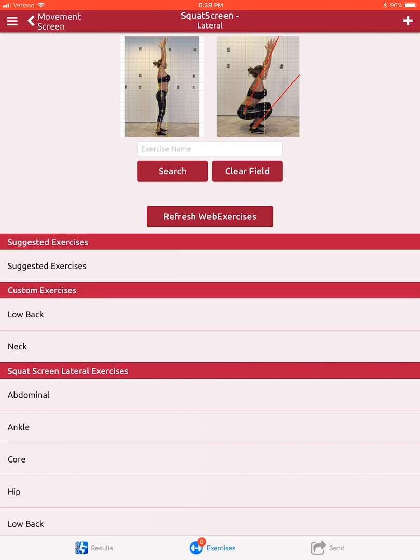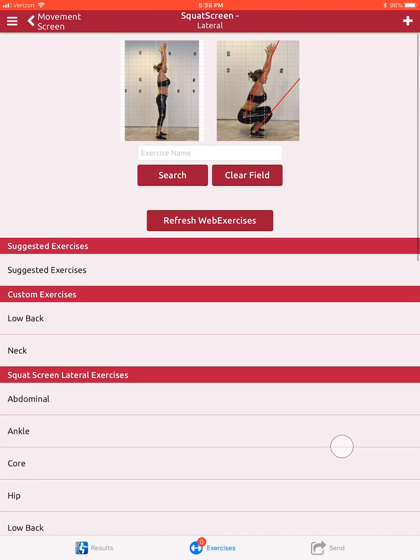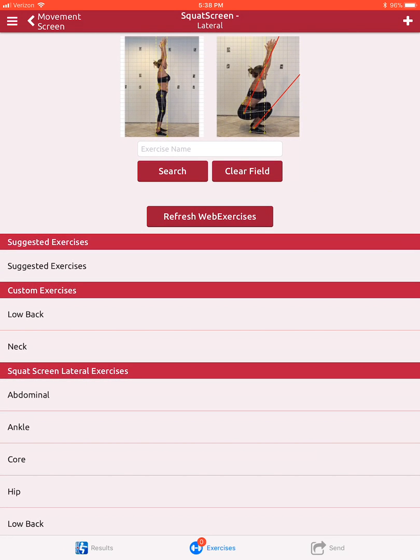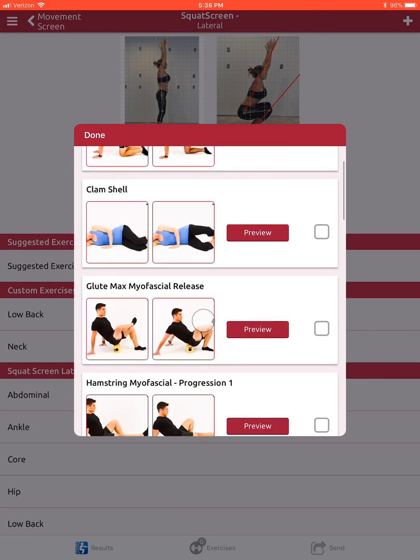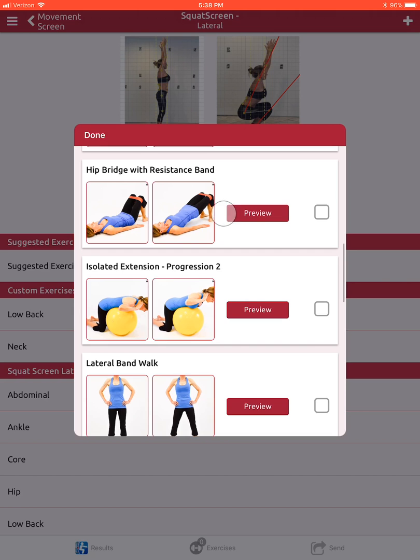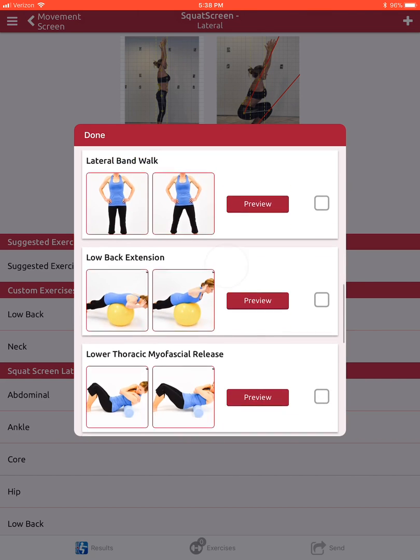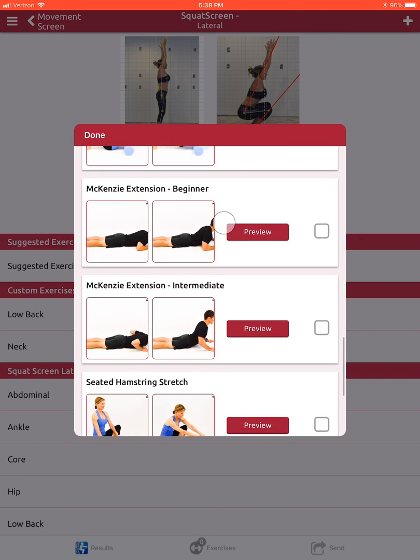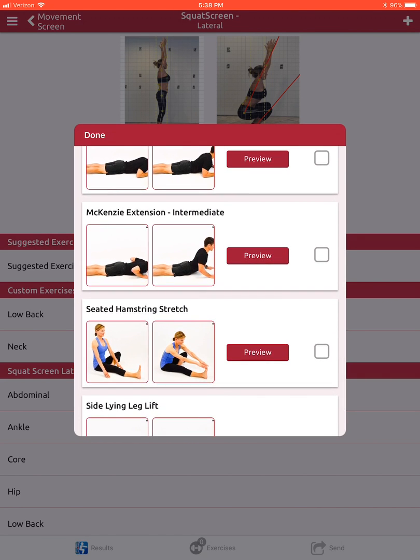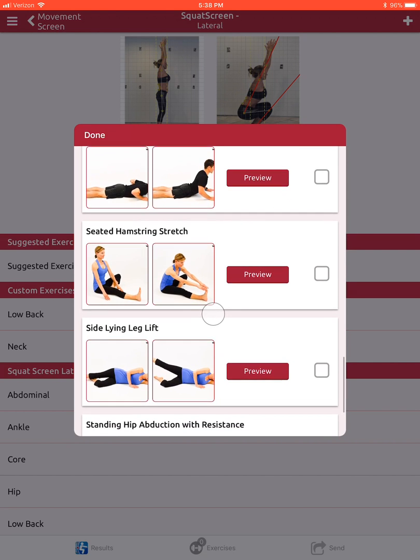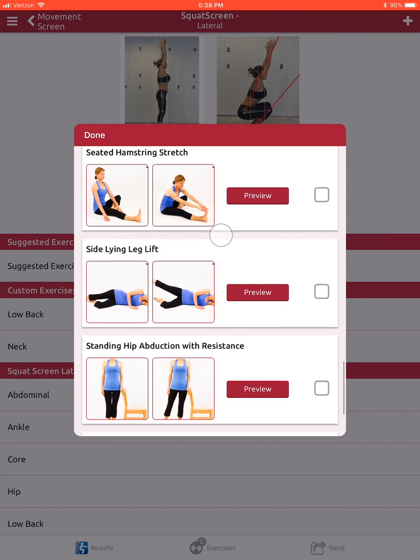If we click exercises, at this point we could go through and manually select what exercise to suggest to the patient or client, but if we click suggested exercises, these are grouped specifically based on that lateral squat — correctives that you can decide are applicable to your client or patient based on their fitness level.